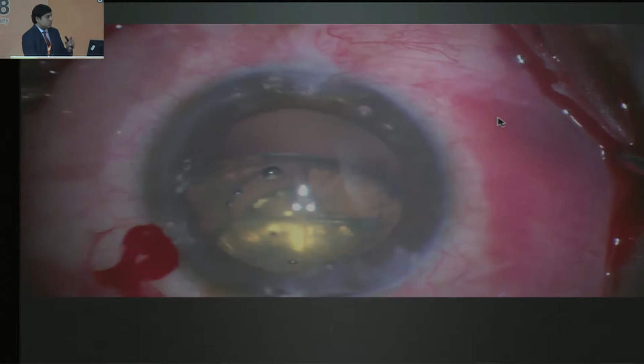These are situations where you really want to be certain that you are indeed carefully ensuring that the capsulotomy is complete. So you want to use your capsulorhexis forceps and carefully tear so that if there are any tags that remain, you're not letting those go radially.